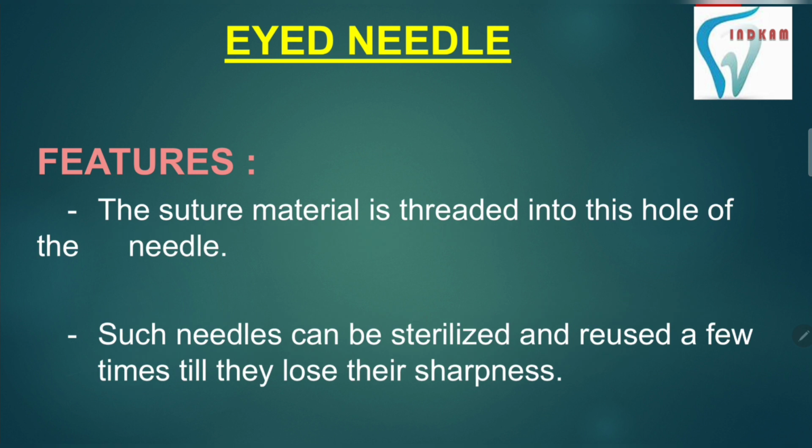The suture material is threaded into this hole, the hole which I showed you here. The suture material goes like this through this hole. Such needles can be sterilized and reused a few times till they lose their sharpness.